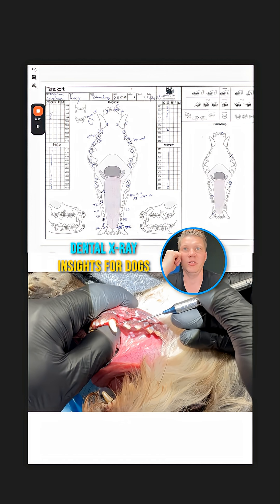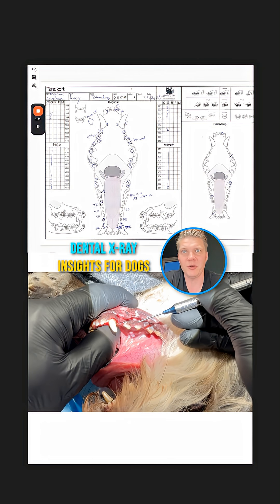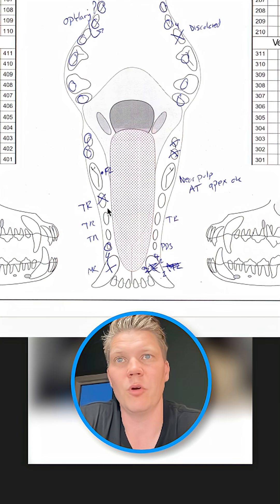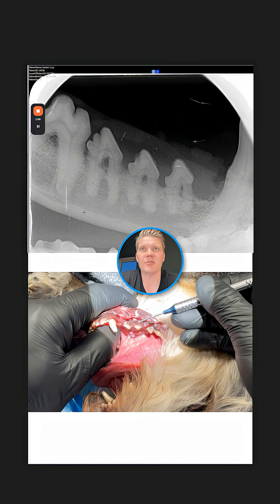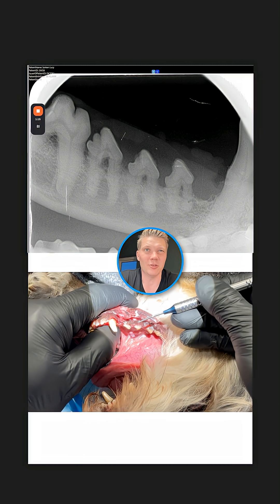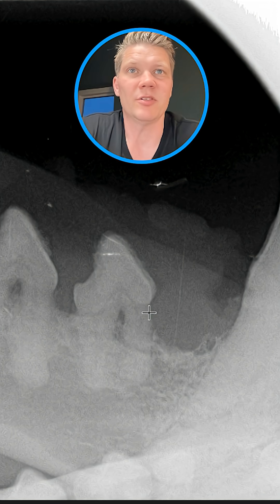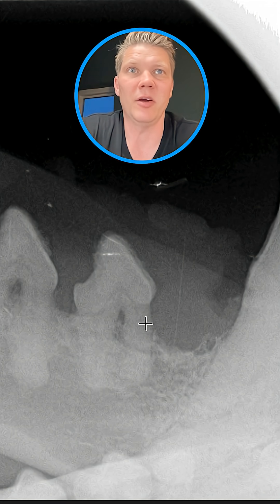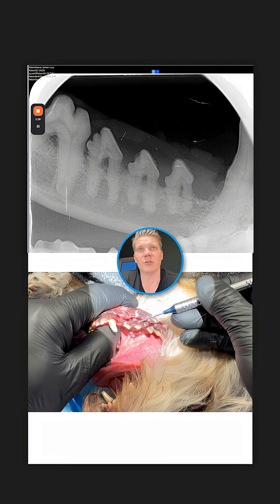Looking at the dental chart, TR stands for tooth resorption. We're looking to extract tooth 408. On the x-ray, there are both resorptive lesions and ankylosis — this is a very old dog, so that's almost expected. There is some bone loss here, but not a significant amount — this is like a PD2, which looks okay.